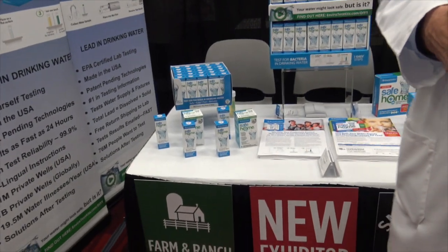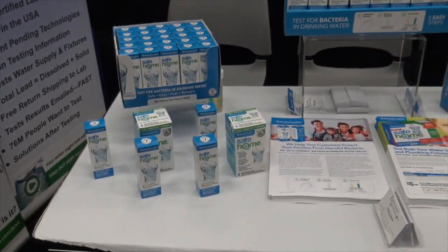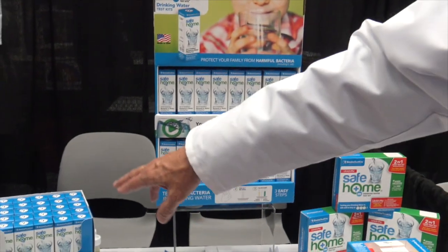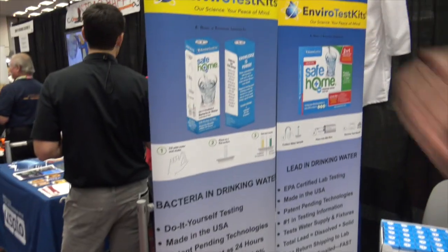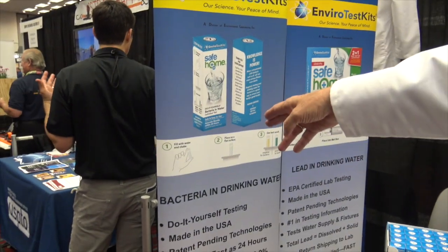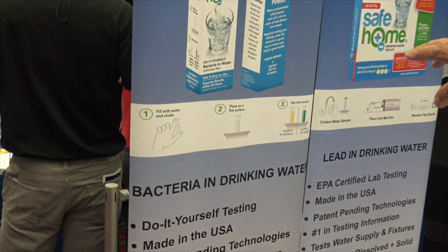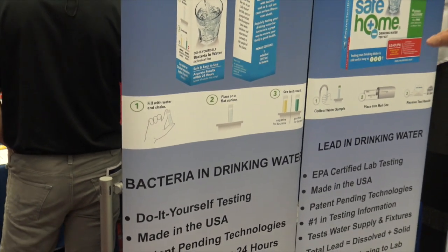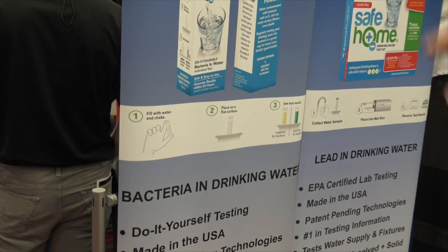The bacteria in drinking water test kit is here — we have it in a sidekick and in a shelf display, and over here on the banner. Essentially, you just put the water in the vial, shake it, sit it on a flat surface, and in 24 hours you'll have your test results.